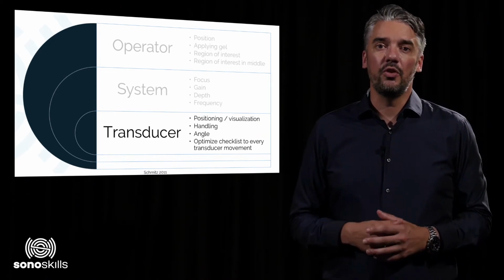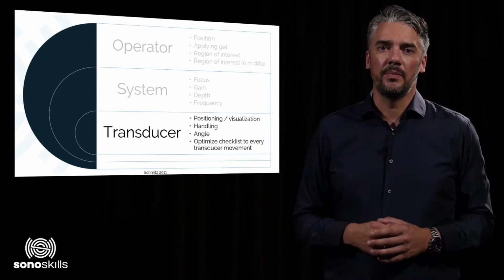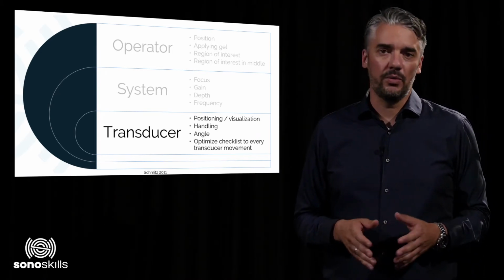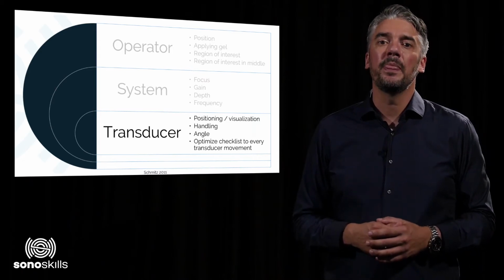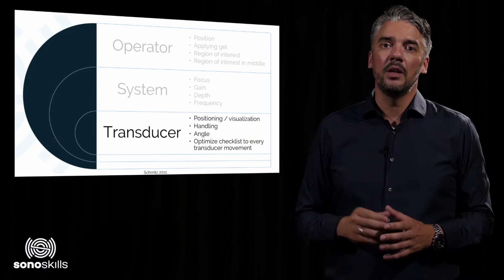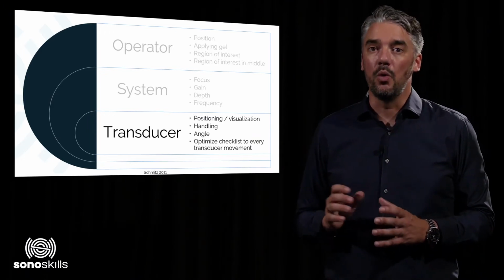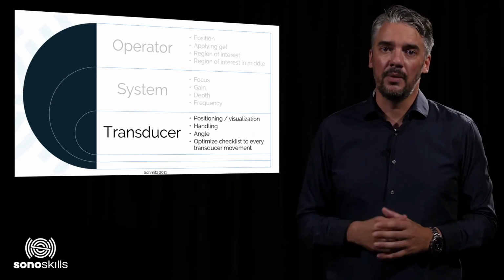The image should be orientated in a reasonably consistent fashion. By convention, when a structure is imaged longitudinally in a long axis view, it is typically orientated so that the left of the screen is proximal and the right of the screen is distal.